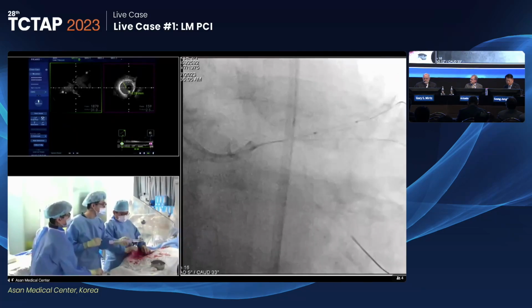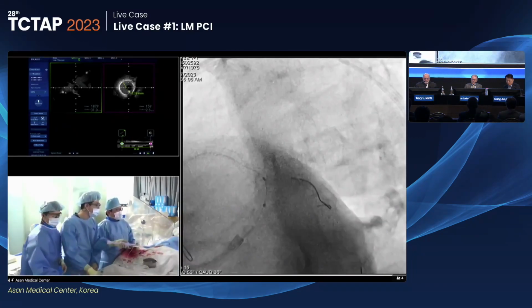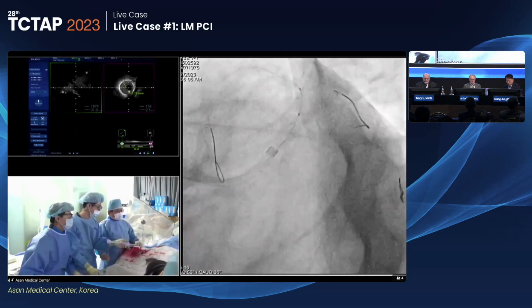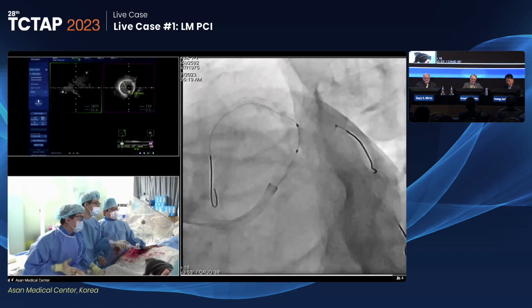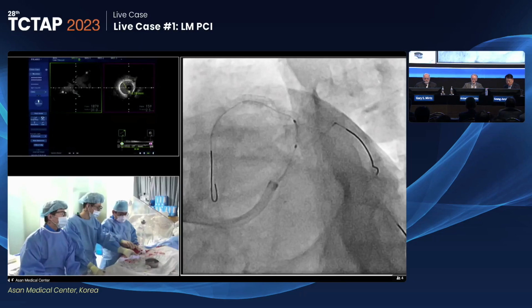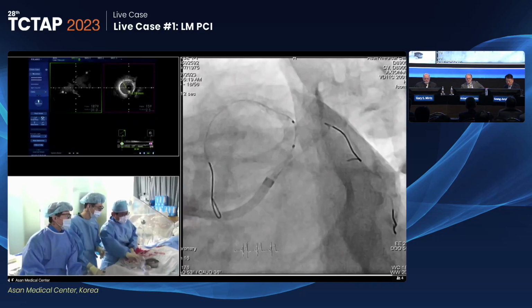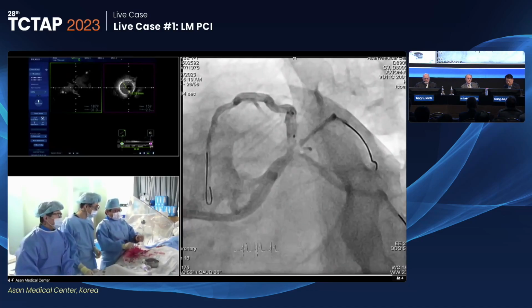Well, what's the downside of placing additional stents in a 48-year-old? The outcome is that you will have events in 10 years. These stents are going to be a risk for sure. Well, we don't know. If you actually continue his course, it's not the last 10 years.